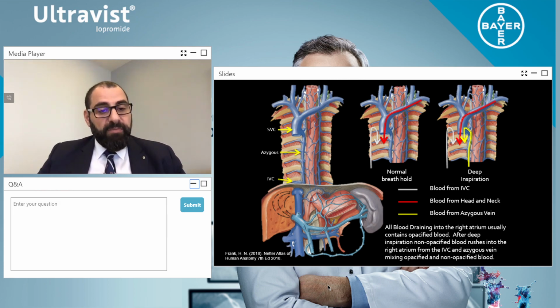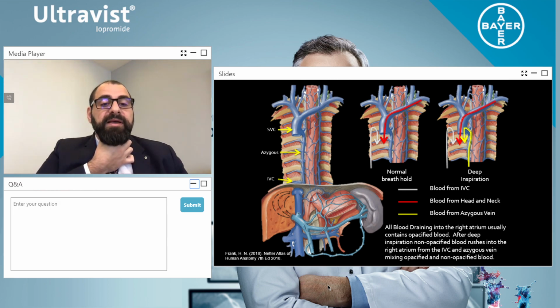Very simply, when you breathe in and hold your breath, people do it with their mouth closed. So let's do a test now. This is the first time I'm going to do this online. If you get your 2 fingers, just put them on your carotid pulse and feel your heart rate, okay? Now, we're going to do 2 breath holds. What I want you to do is for the first breath hold, make sure the first and the second breath hold volume going into your chest is exactly the same. So we're going to now hold our breath for 10 seconds, okay?